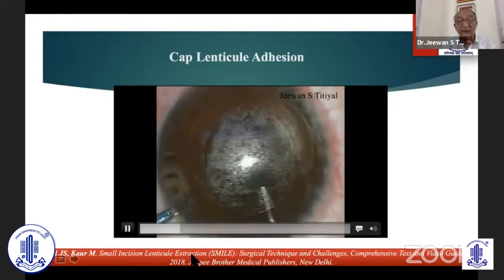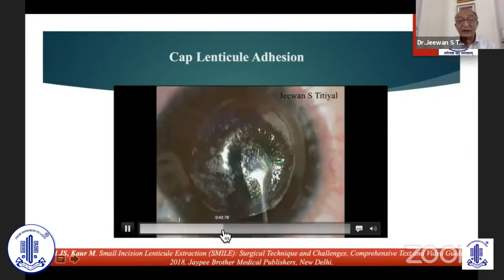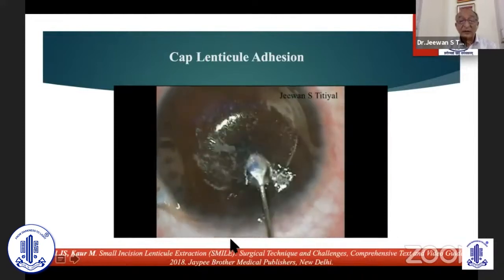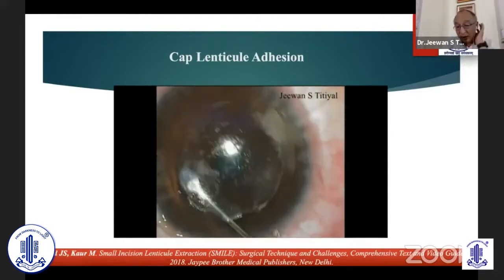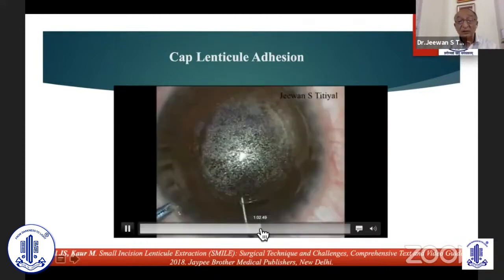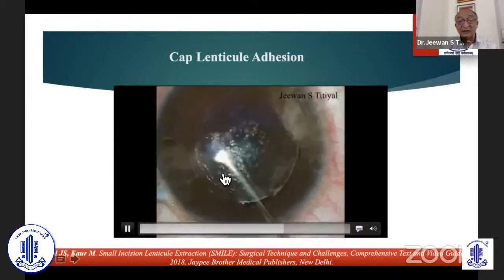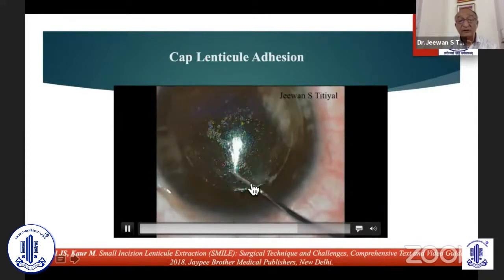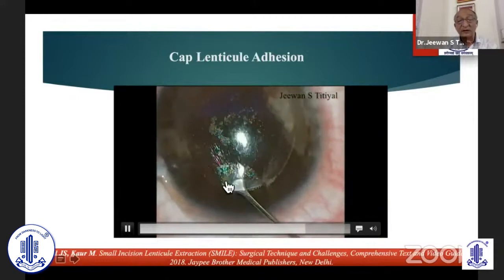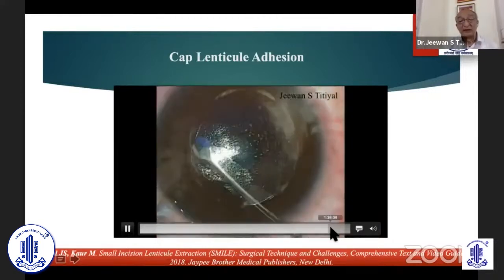So this is what I am trying to do — a posterior dissection. Subsequently I have done an anterior dissection in this particular case. After anterior dissection, I was struggling to see the posterior dissection — I can't go posteriorly. You have to analyze what exactly went wrong to begin with. You must see your videos subsequently and rectify your steps. Looking at the video: I was initially dissecting, had gone posteriorly — you can see the edge which is delineated. In such cases, you can enlarge the dissection towards the cap side using the reverse side of a dissector. This makes the edge more visible, and you can insert your dissector over the lenticule to achieve a nice anterior dissection. Once you identify this correctly, you can dissect out very effectively.